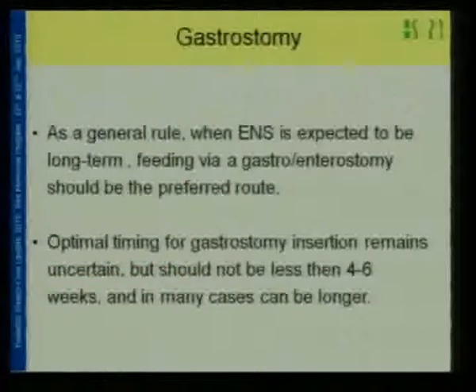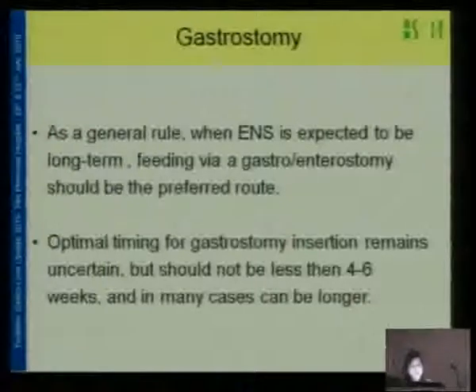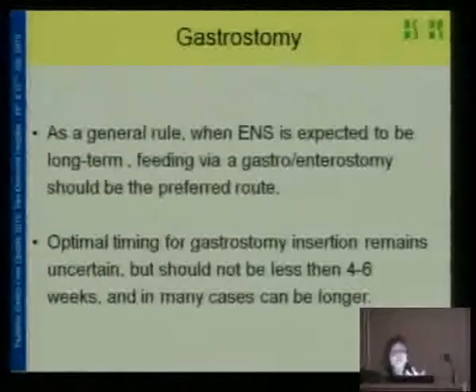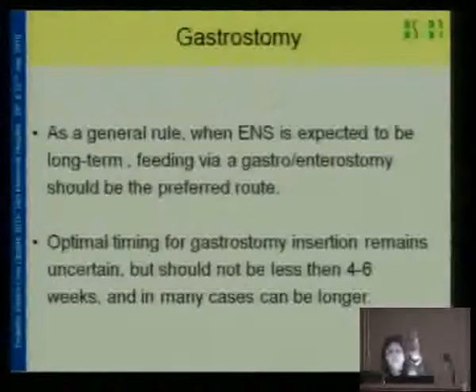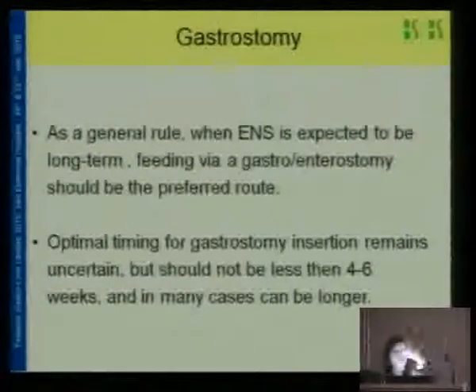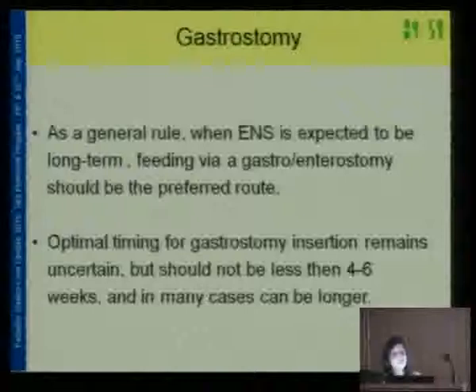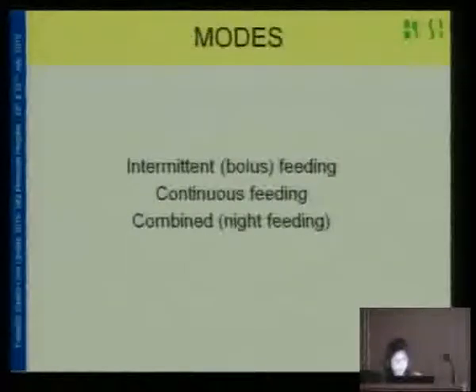Now gastrostomy, as a general rule, when you think that feeding is going to be required for more than 3 weeks, then rather than going for tube feeds, please proceed for gastrostomies. I have had patients with fistulas from corrosive injury, a lead battery. They swallowed a battery and it was a tracheoesophageal fistula or something. So the best thing I did was a PEG and allowed it to heal. We saved a thoracic surgery for that patient.